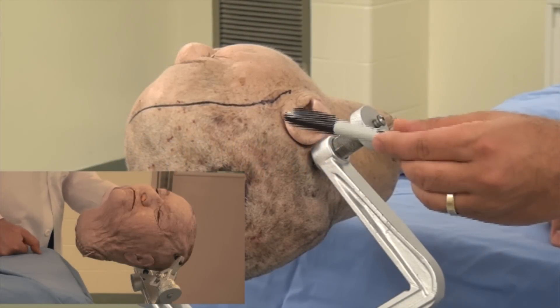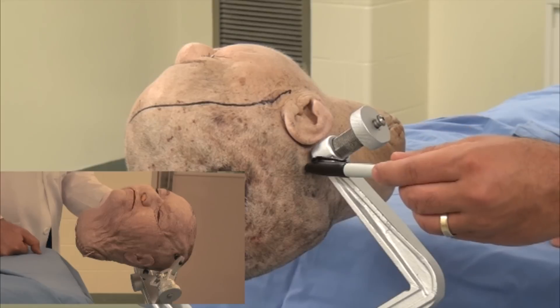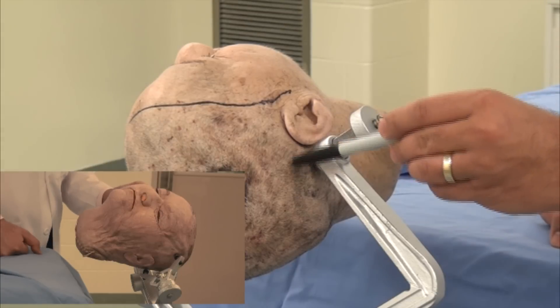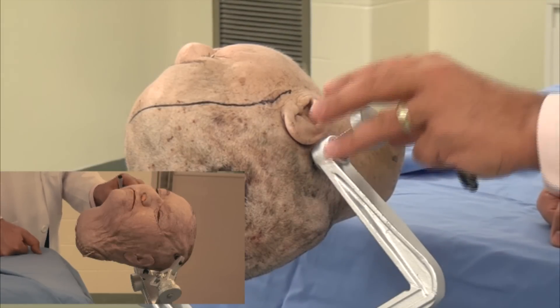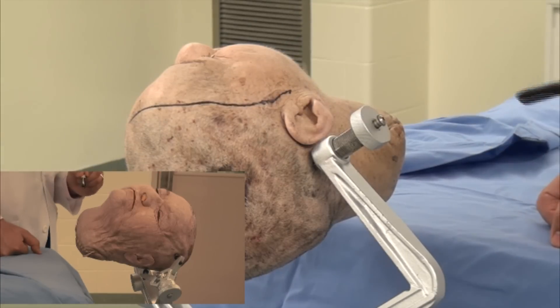For placement of the pins, the single pin may be placed behind the ear, as you can see, along the superior nuchal line and outside the zone of the suboccipital muscles. This mode of pin placement maximally prevents the bulky piece of the single arm from being away from the working zone of the surgeon, which in pterional craniotomy is obviously in the area of the pterion.